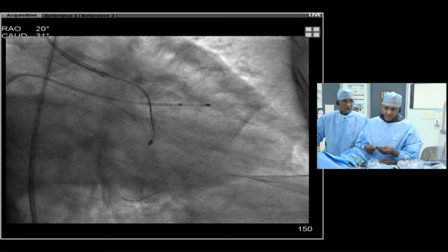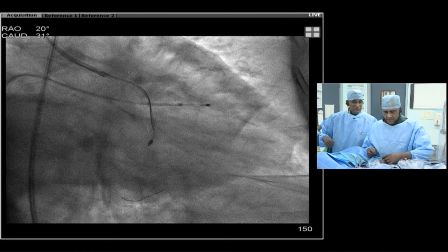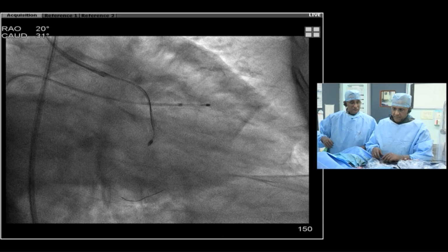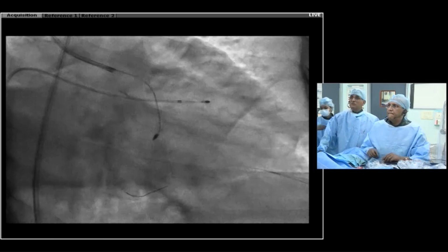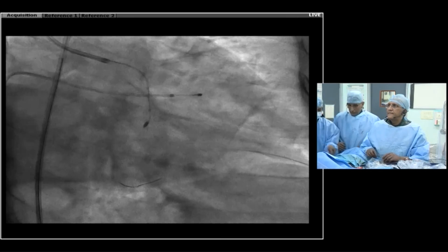The issue at this point is that the burr is caught in the tightest part of the lesion. I was talking to Miroslav here, and the reason that he had said to move it forward a little bit was to make room for the wire to be able to cross through in that segment. Torquer.